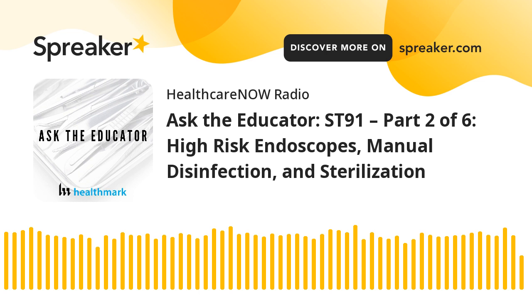And of course, my favorite topic, moving to sterilization might be another option if they have that availability within their setting, depending on the type of scope and its compatibility. We do want the industry to migrate to sterilization anyway, so this might be part of that opportunity. If I can't manually disinfect it, can I sterilize it?